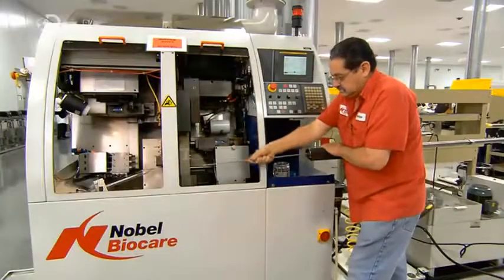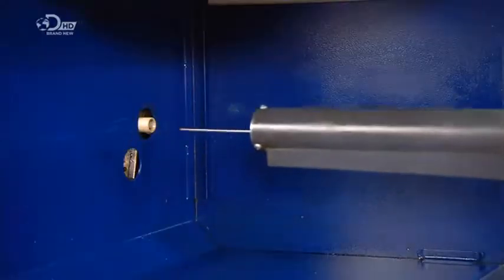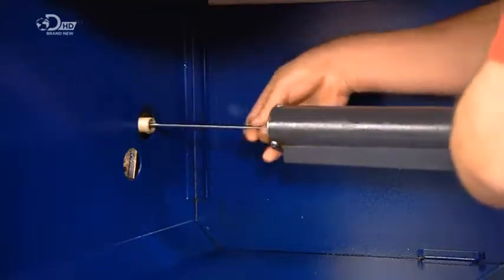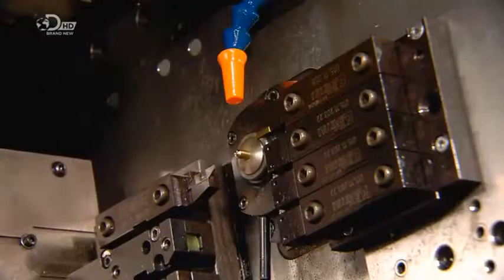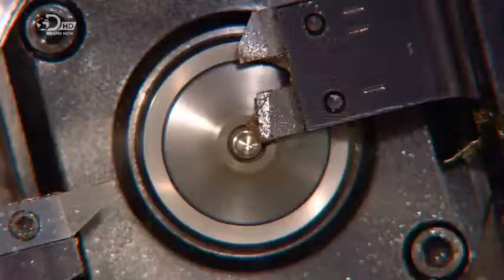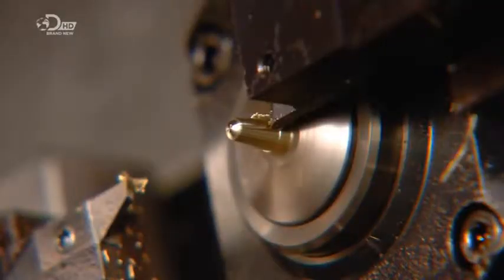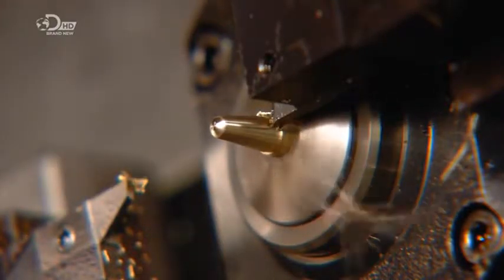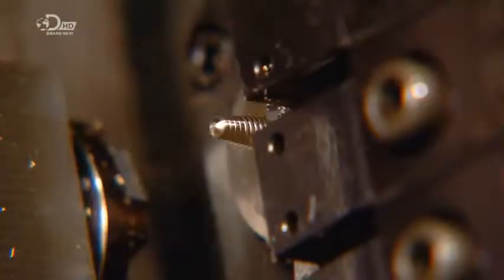The technician inserts the rod in a long holding device, which keeps it straight as it feeds into a lathe system. The titanium rod spins as computerized tools slim it down and cut threads into it. These threads will help anchor the implants in the patient's jaw. The lathe pushes the rod out and then pulls it back in repeatedly to assist the shaping process.